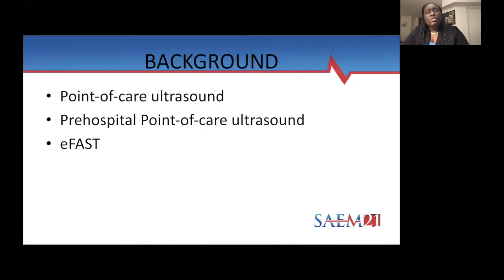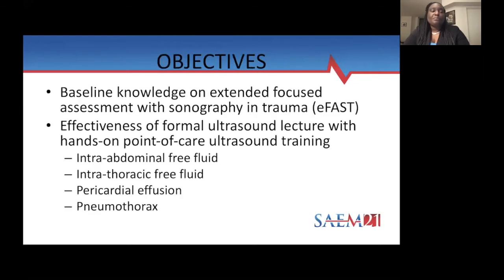Pre-hospital point-of-care ultrasound has many applications. It is a tool for medical and trauma resuscitation. It can be used to gauge the efficacy of chest compression. Pre-hospital point-of-care ultrasound may expedite pre-hospital intervention of the identified abnormality and prevent unnecessary intervention. Therefore, ultrasound in the pre-hospital setting is an important tool to assist in detecting or ruling out potentially harmful conditions, which may reduce morbidity and mortality and in turn improve patient care.